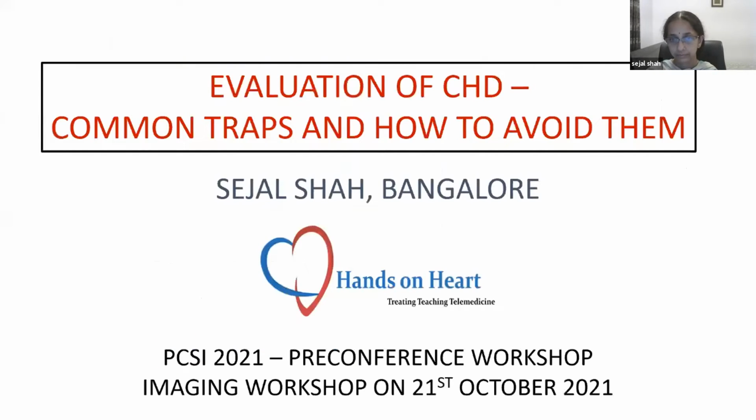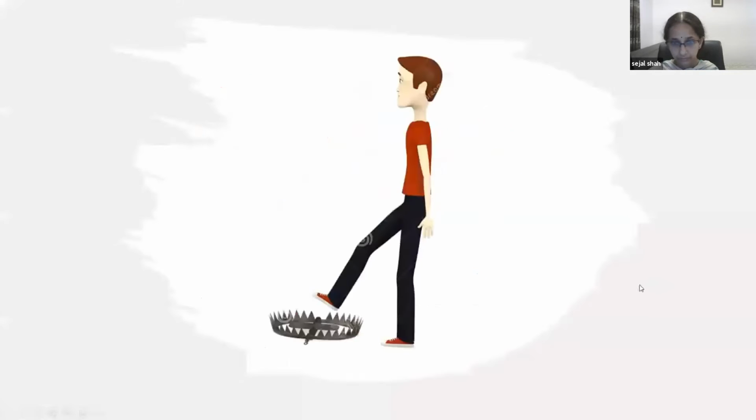We will be starting our session with the common traps and how to avoid them. Traps are situations which are not very clear at first glance. Such situations do happen in our practice, and because echo is an imaging modality based on which surgical decisions are taken, it's important for us to understand how we could avoid them. I'll be sharing few cases where I have experienced traps in a similar way.